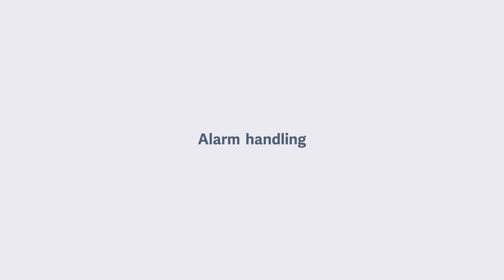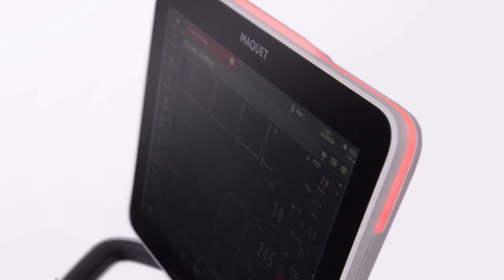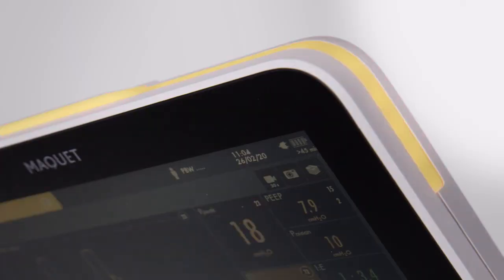The alarm lamp is located at the top of the screen and is visible from 360 degrees. There are three colored alarm indicators: red, yellow, and blue. Red is the highest priority. A yellow alarm indicates a medium priority condition. The blue alarm indicates a low priority condition.